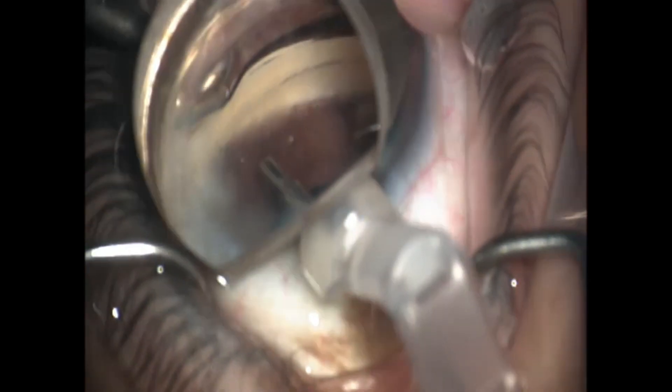The nice part about this iStent Infinite — where it gets its name from — is we are no longer limited to the amount of clicks you can do to implant one of the stents. You have an infinite amount, as long as you continue to reload the stent or don't drop the new stent into place, then you can continue to actually try to inject.